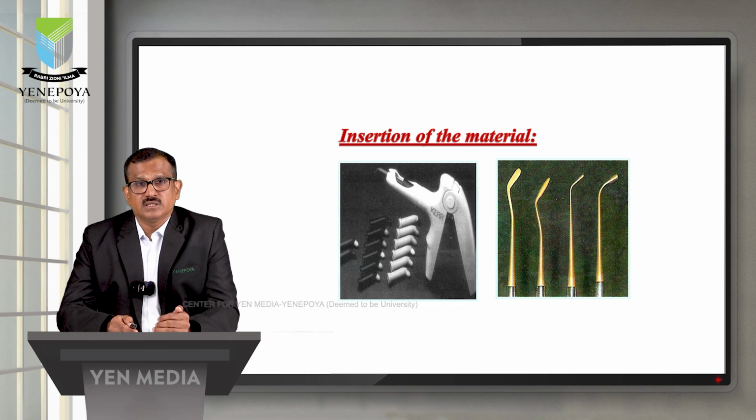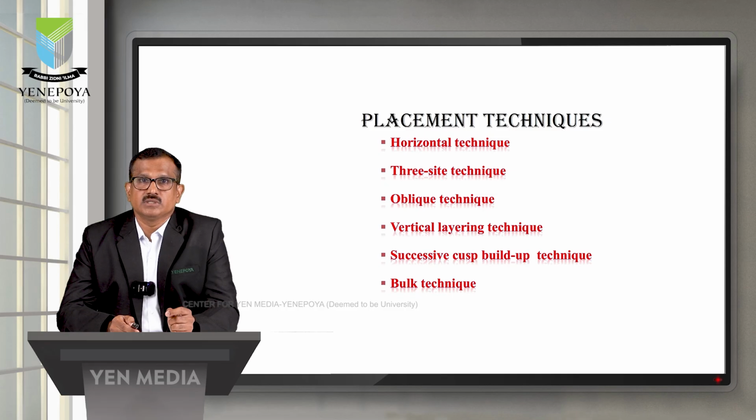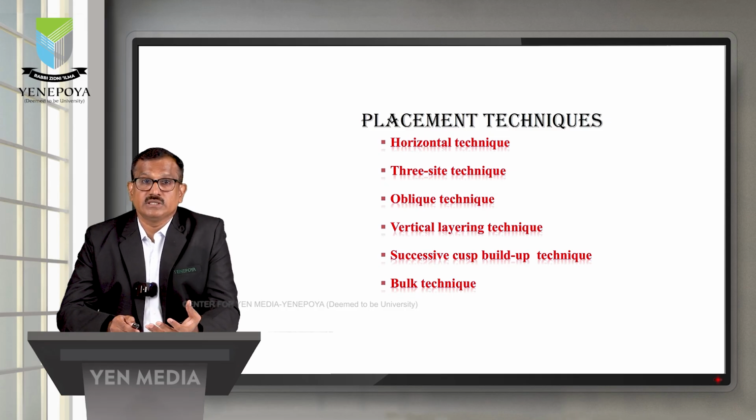Whichever is comfortable, but ampules with guns are seriously a good choice for bulk buildup, when the base dentine is done, when it is a very huge restoration. Otherwise an instrument would be the right technique to use. Then for even bulkier restorations, we can go for the injection mold technique.